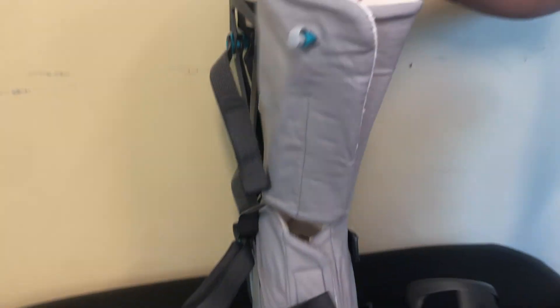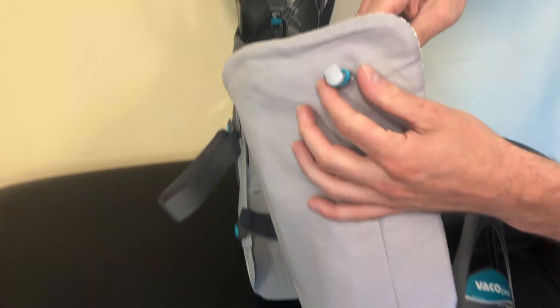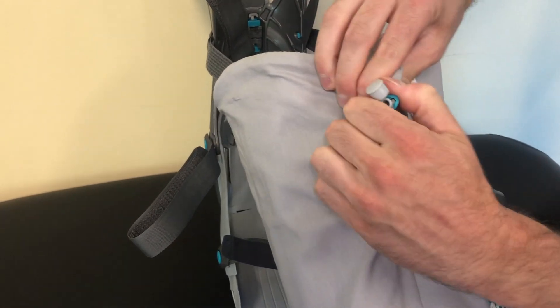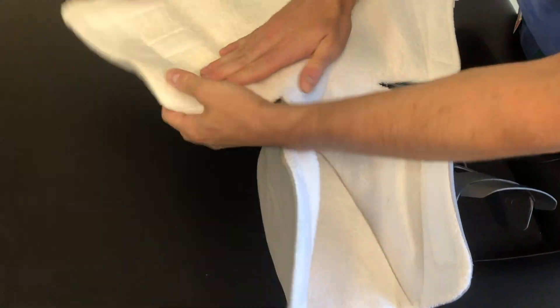Step two is to locate the valve at the top front portion of the liner. Uncap the valve and pull on the valve ring so it's flush to the nozzle. Smooth out any uneven parts of the liner, depress the valve ring, and cap the valve to ensure a proper fit.